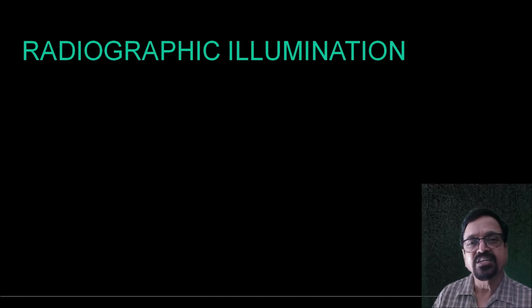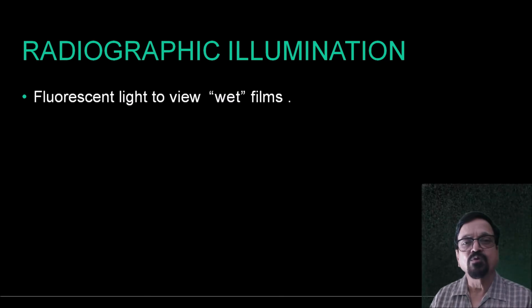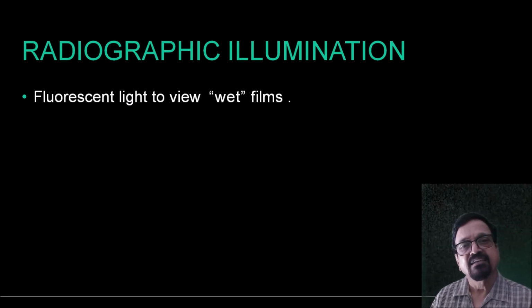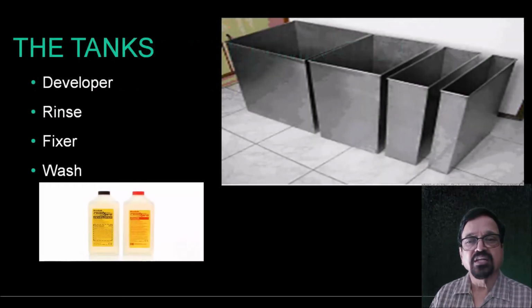If there is dust or any other impurities coming inside, we have to check it and clean the darkroom, and for that we also need a routine light which is not used when we are doing film developing work.